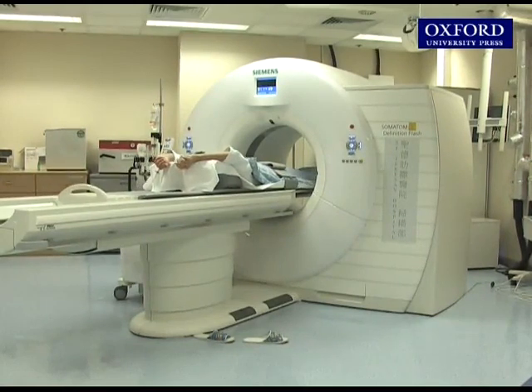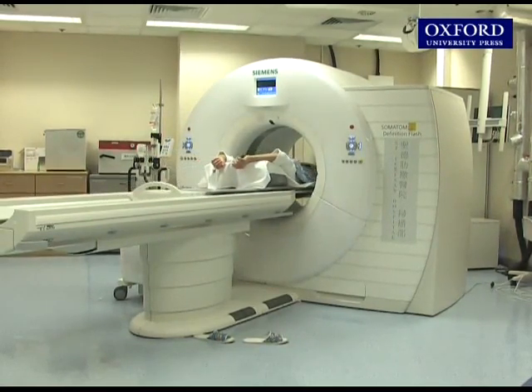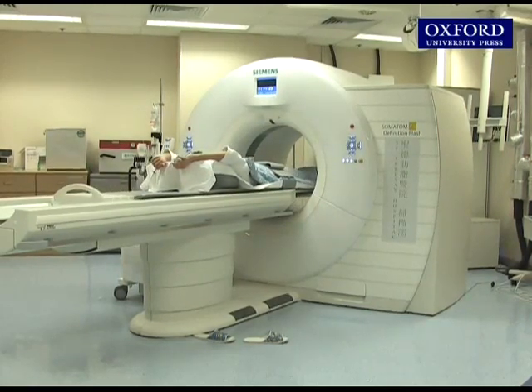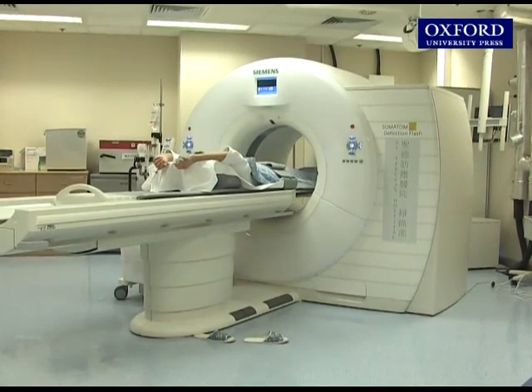Contrast medium, if required, is injected now to coincide with the scanning. Several passes may be made if we want to see different stages of contrast enhancement.